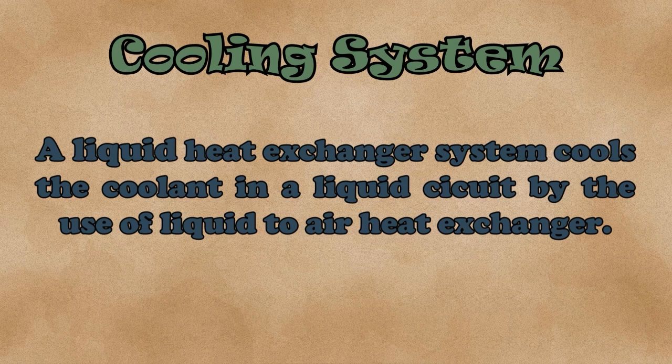Cooling system. A liquid heat exchanger system cools the coolant in a liquid circuit by the use of a liquid-to-air heat exchanger.